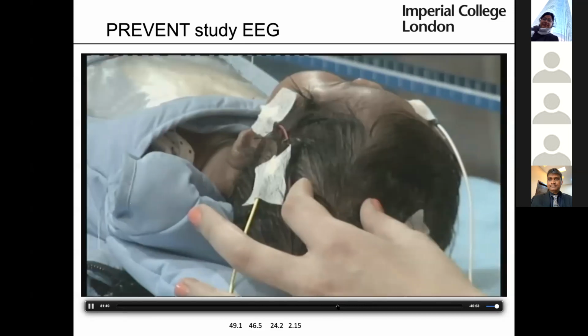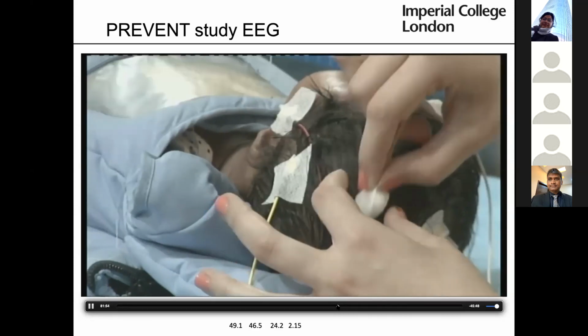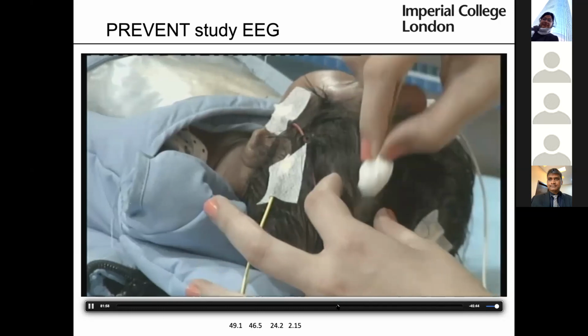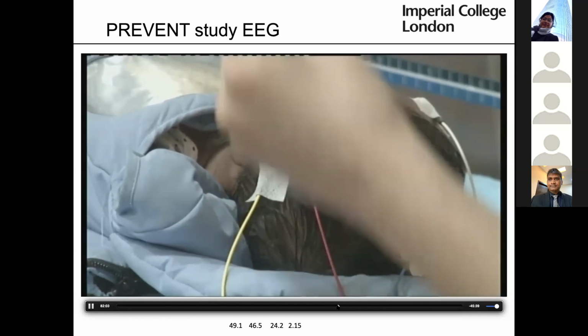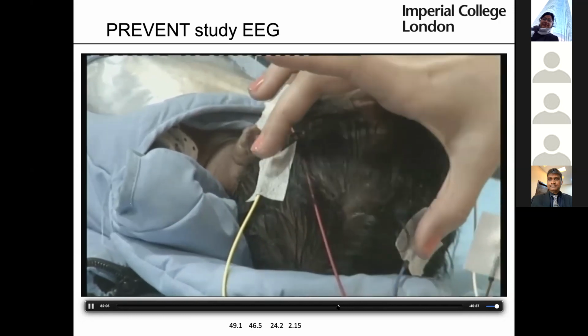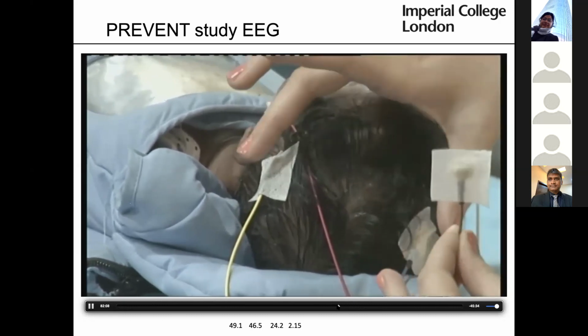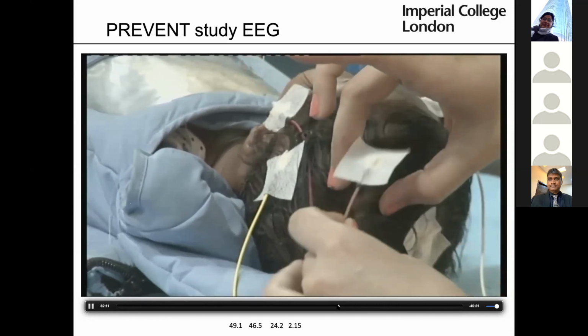So I'll show you some. This is how you're preparing. You're parting the skin and applying new prep now. Make sure you part your hair. Part this side. Just make sure it's in line. So just use your hands basically. So you got this, and then just make sure it's in line. There we go.